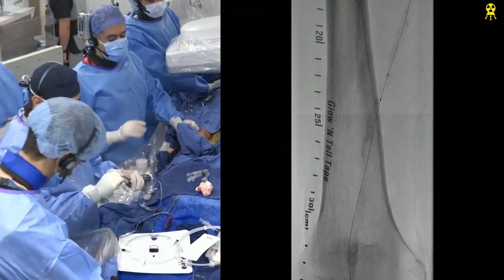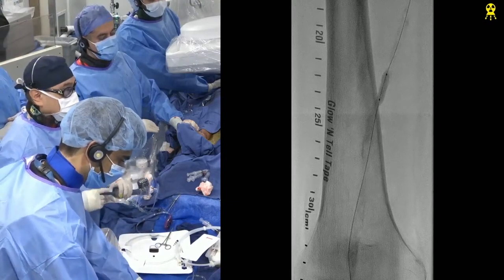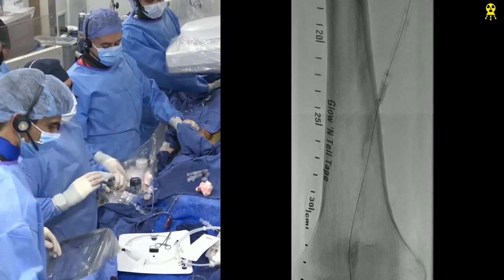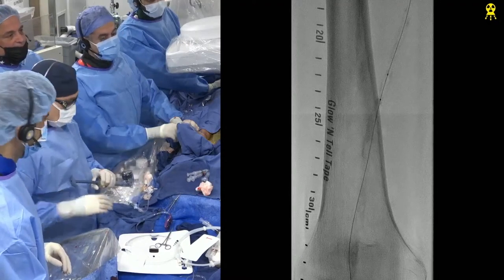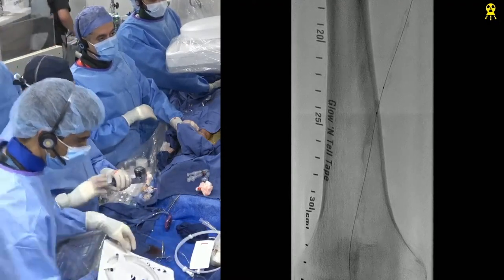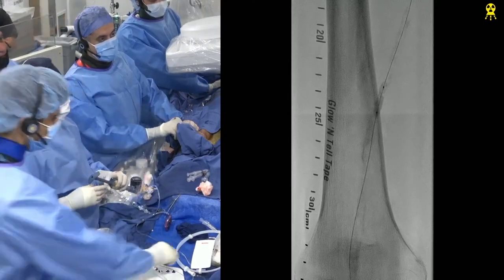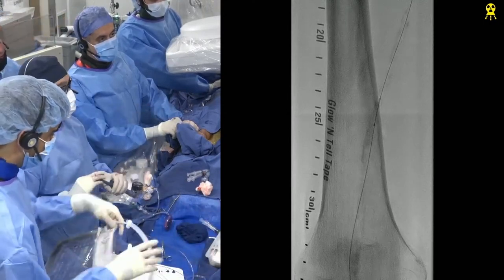There's some quick balloons in this area. This is an 014 renal balloon, for those of you who don't know. It's a great balloon for the renals. It's a peripheral balloon, comes in 5, 6, and 7. And it's something that I think everybody should have on their shelf for these kind of cases. Now we're just going to balloon this open.